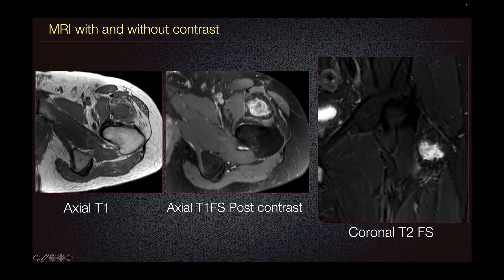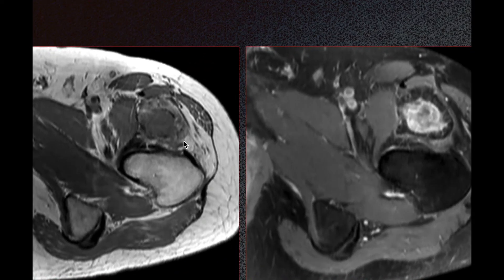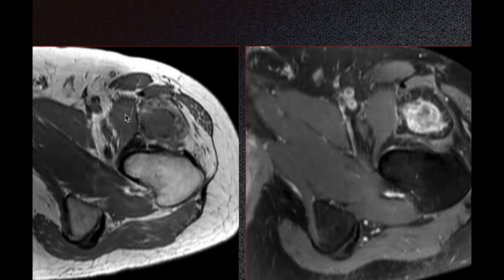We can see that there is peripheral signal that is the same signal as the adjacent bone, and then an iso-intense component centrally, iso-intense to the surrounding muscle. On the axial T1 fat sat post-contrast imaging, we can see a hypo-intense periphery of this lesion and some heterogeneous enhancing components centrally.